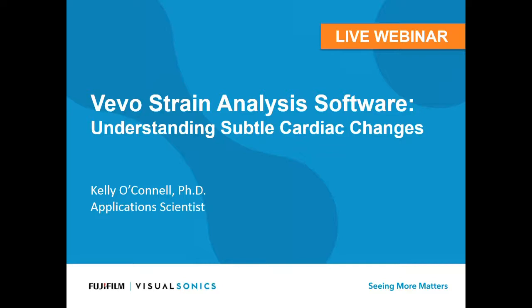Thank you all for joining us today for this webinar, which will be on the VevoStrain analysis software, which is an excellent piece of software for digging into subtle cardiac changes in your animal models, and it'll be presented by Kelly O'Connell, one of our application scientists.